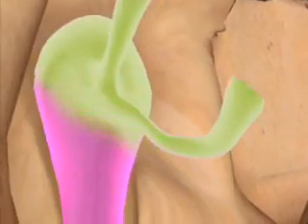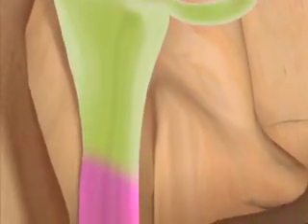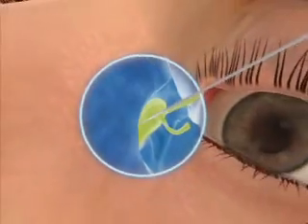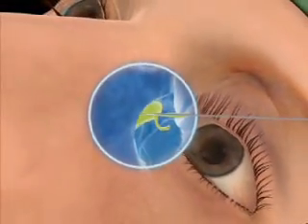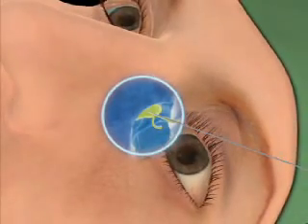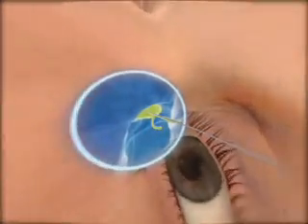Apart from these innovations, our line of research is currently looking at obtaining tissues that allow maximum absorption of the light energy delivered by the diode laser, thereby enhancing its action to allow shorter exposure times. The purpose of our work in the treatment of the lacrimal system is to identify techniques that are easier to perform and less harmful for the patient, using the innovations provided by endoscopy and laser technology.